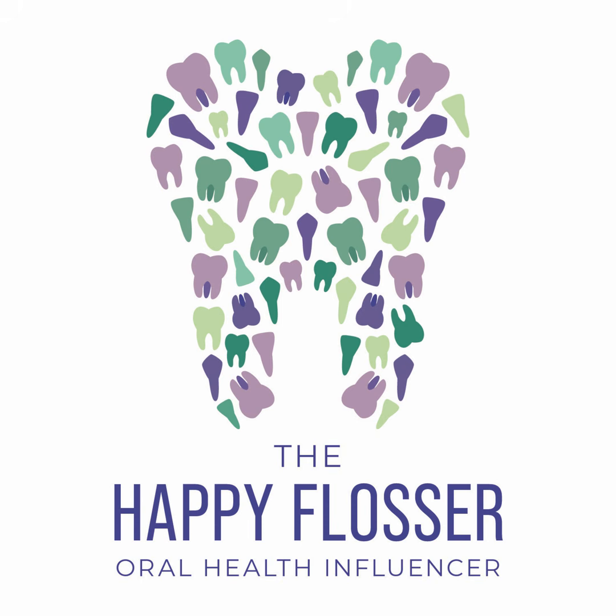Now, remember back to your elementary school years that there's molecules that make up everything, and that density is based on how close those molecules are to one another. So something that's more solid has molecules that are closer together, and something that is less solid has molecules that are further away from one another. So how does this relate to the significance and importance of your radiographic images? When we're looking at radiographic density, we're looking at the amount of darkening or the degree of darkening on a radiographic image.